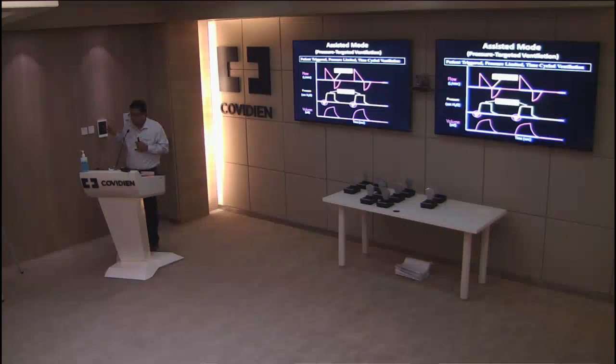And most of the newer ventilators give you a choice of setting a fixed inspiratory time, 0.8 seconds, 1 second. Generally, most patients are comfortable with an inspiratory time of between 0.8 to 1.2 seconds. Generally, that's what the usual inspiratory time should be set at. In asthmatics, COPD, sometimes you might keep a shorter inspiratory time, but generally 0.8 to 1.2 seconds is the usual comfortable inspiratory time for most patients on a mechanical ventilator. And so whenever you're calculating I ratio, rate, etc., in your mind you should calculate what inspiratory time is set on the ventilator, because that is what is going to remain constant.